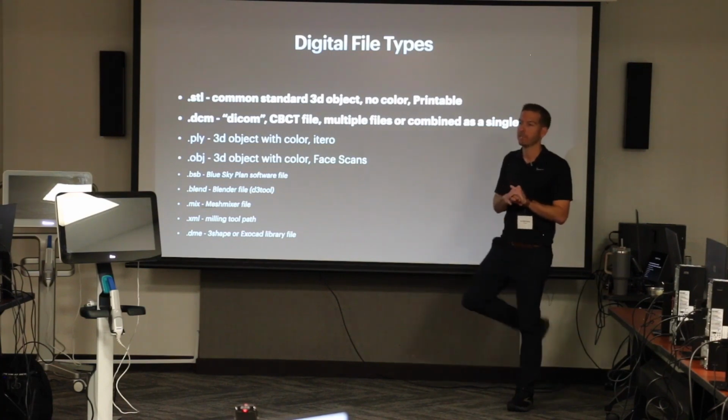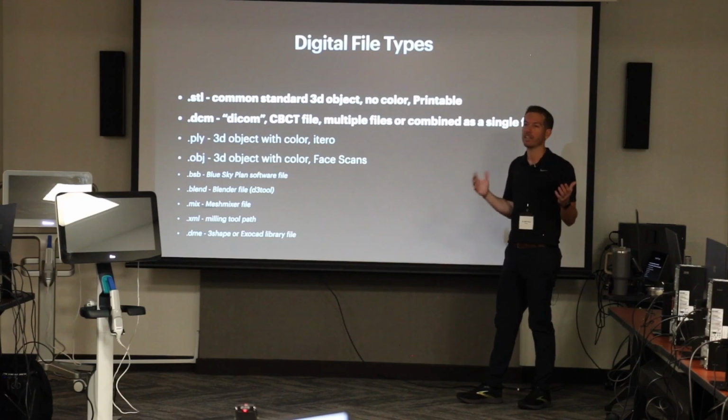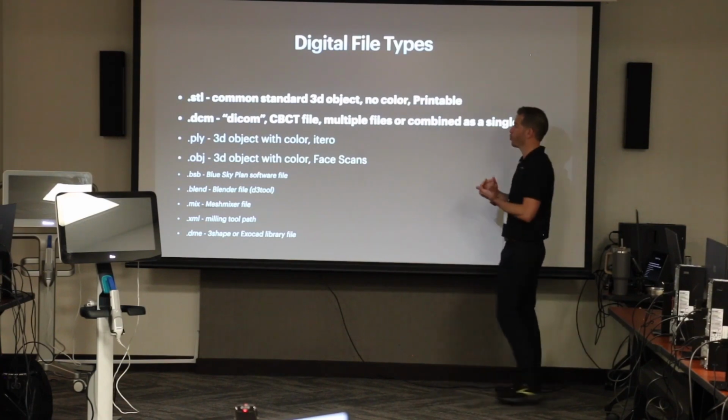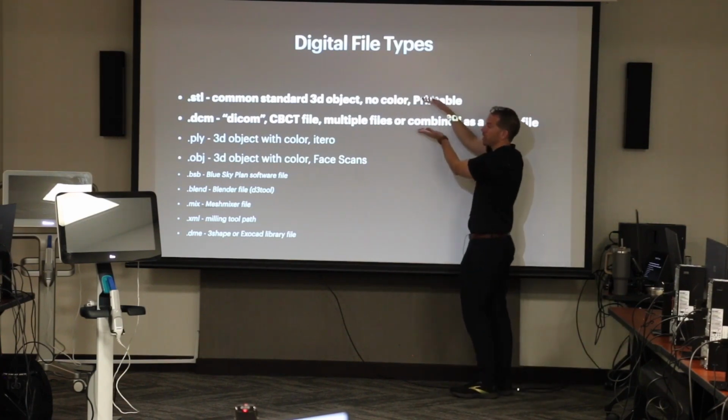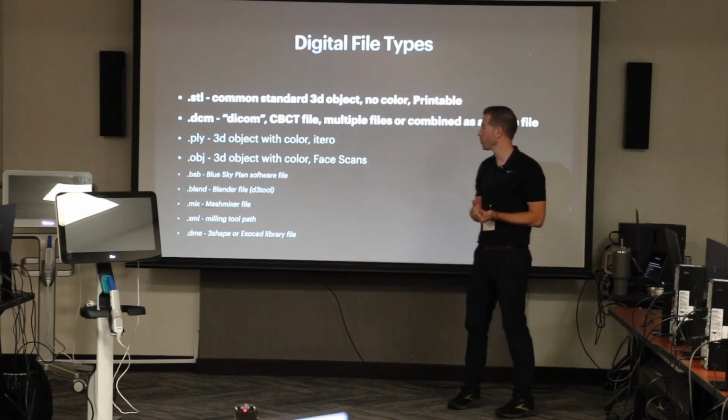We all have to be on the same page here because this is where we can get lost. So let's define the language and the terminology so that when we use these terms, everybody understands what we're talking about. And the two things you got to leave here knowing at a minimum are the top two in bold, and that's STL and DICOM. Most of you guys are probably familiar with that.